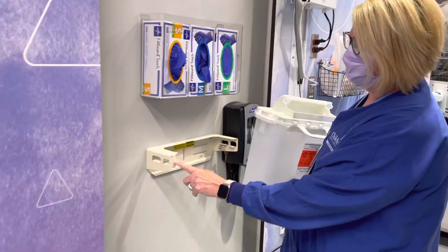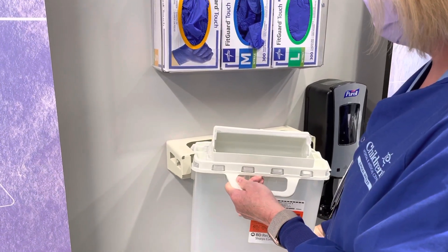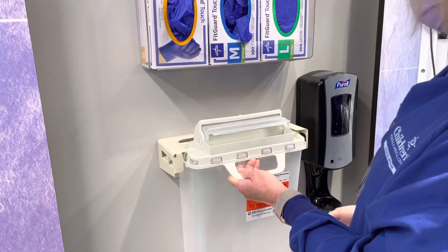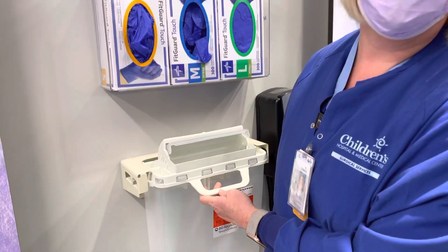To replace it, there is a lip right here on the bracket. What you need to do is feed this part of the sharps container in first, and then slide it onto the other bracket. Then you're going to lock that in place, and you've just replaced your sharps container.